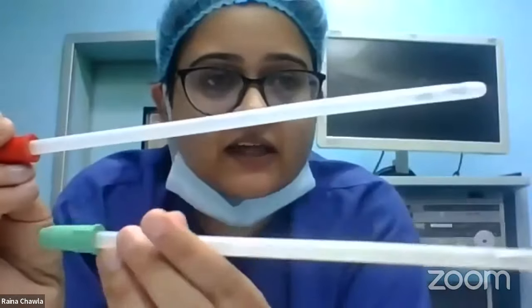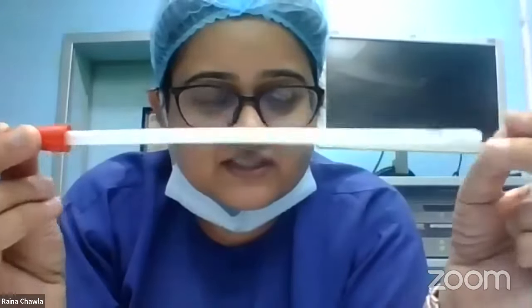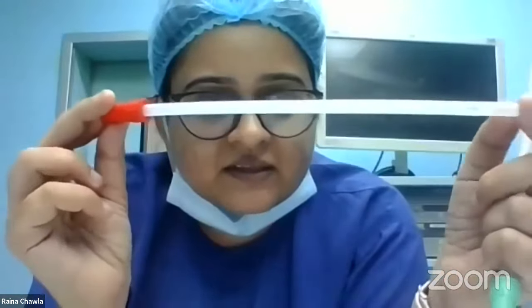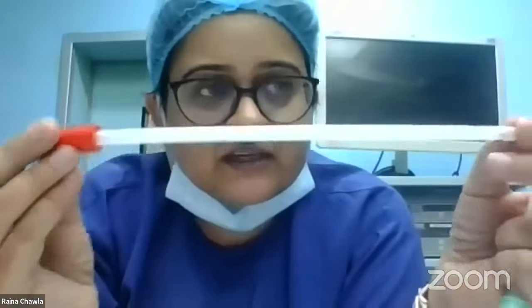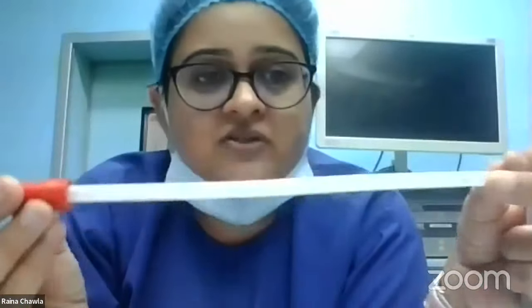And then we introduce that size of the suction cannula. These are the suction cannulas. These are plastic cannulas, also called Karman's cannula. You can see it has a hole at the end to aspirate all the matter. For a 9 weeks MTP, this is what you'll use. This is the cannula you'll introduce after dilating. So if she's 9 weeks pregnant, you will dilate till Hegar's number 8, or some books say Hegar's number 9, and introduce the Karman's cannula size 9, the same size as the weeks of gestation.